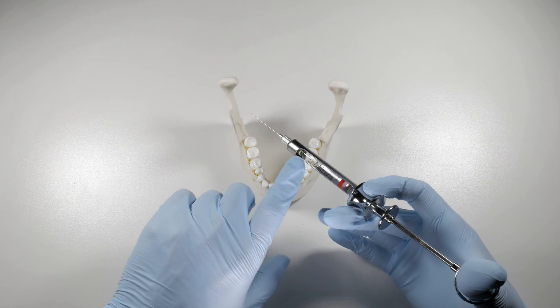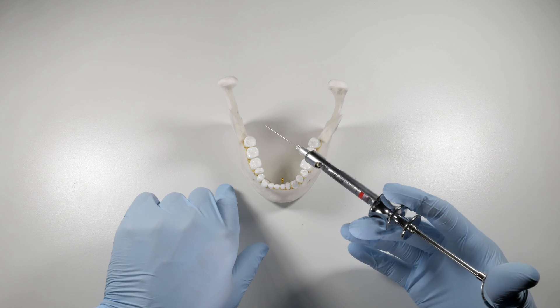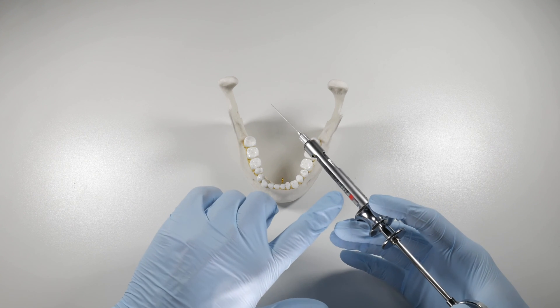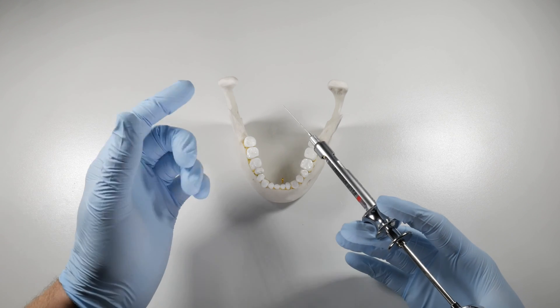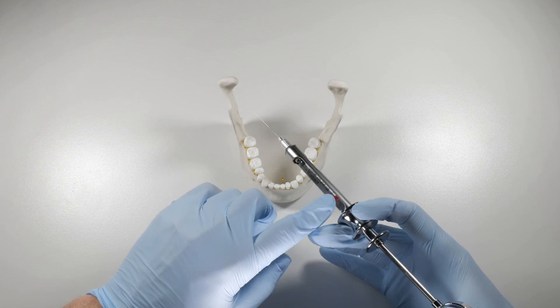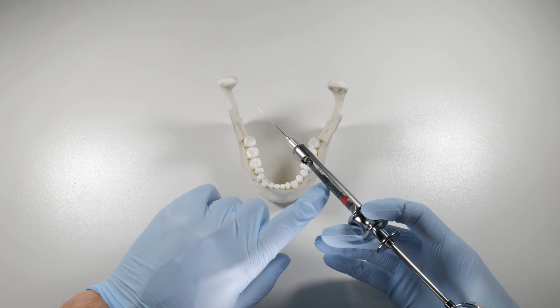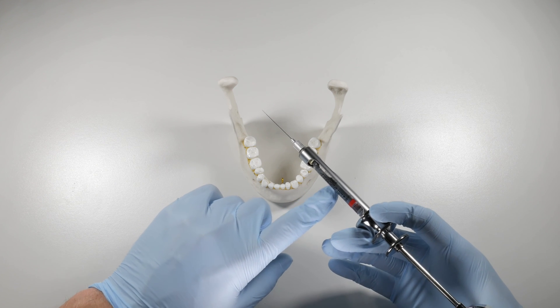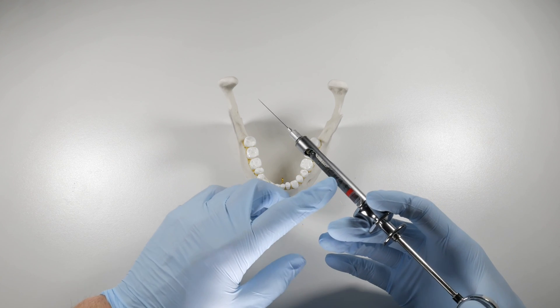I would caution you in areas when you're maybe not resting firmly on bone and you have some kind of seesawing motion — where maybe you're entering slightly more as you're injecting and you're not aware — say in a PSA block, for example. You should try to aspirate again when you're partway through that carpule to make sure you're still not in a vessel, because it doesn't take much. Move a few millimeters and you may have entered a vessel without even knowing.